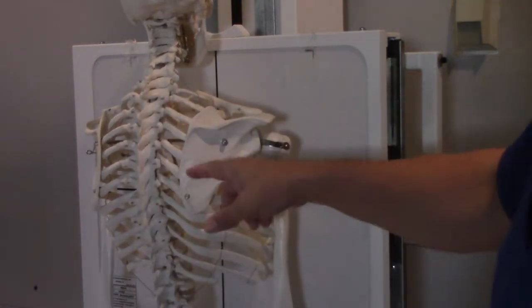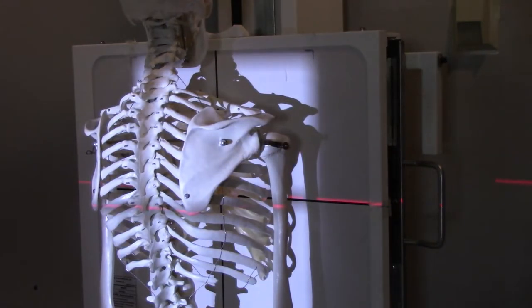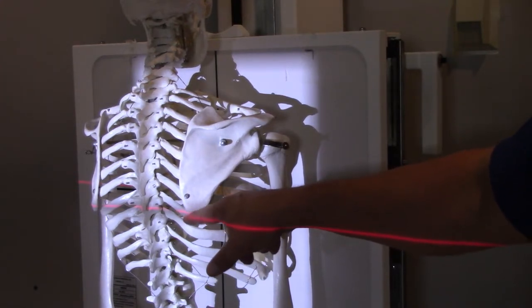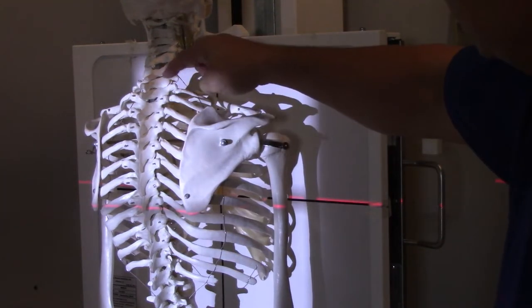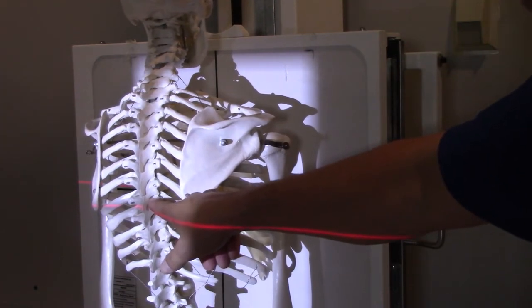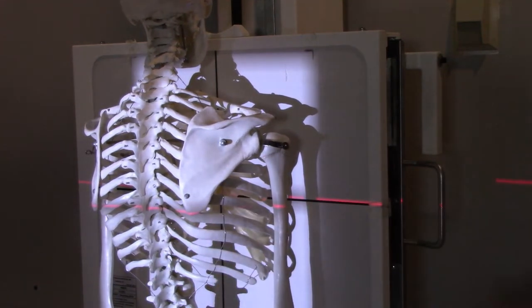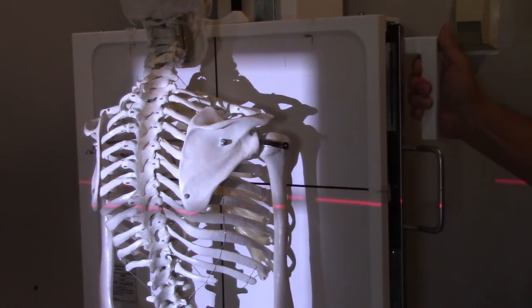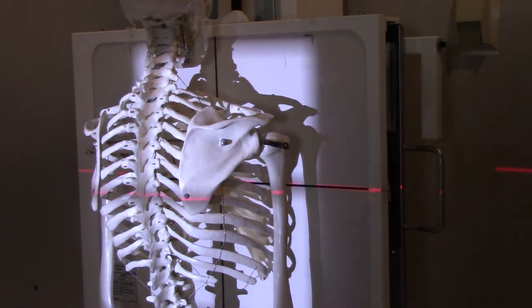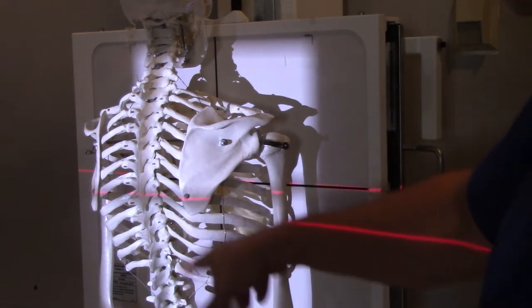So I've got Boney up here, and what I really wanted to show you is this. Let me turn on my collimator light. Okay, I've got that red laser even with the inferior angle of the scapula, but if I go over here and count — T1, 2, 3, 4, 5, 6, 7, 8 — that's putting me at T8. So in reality, what I should do is bump this up about an inch. Remember, these thoracic vertebrae aren't that thick — maybe three-quarters of an inch to an inch. They're not that big.